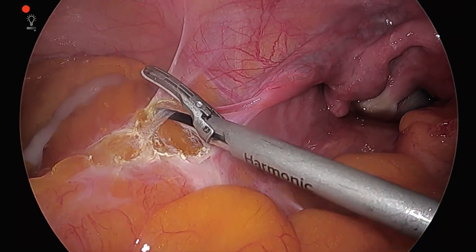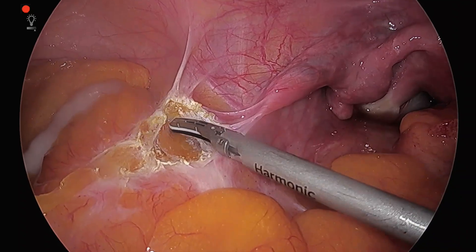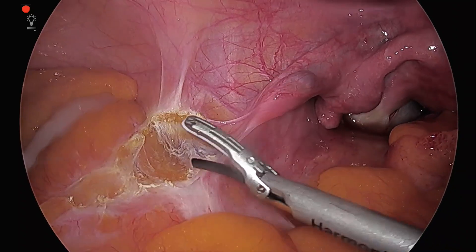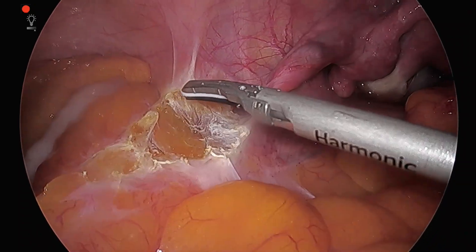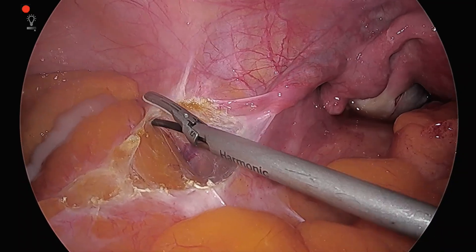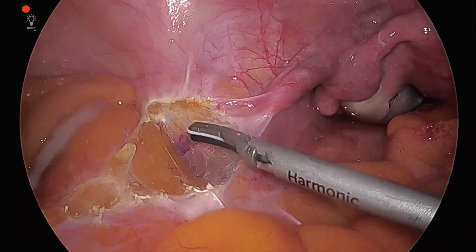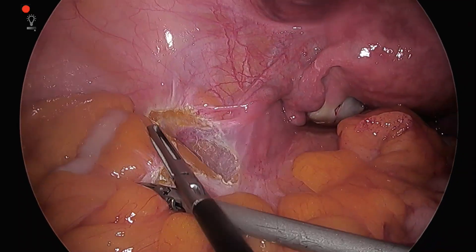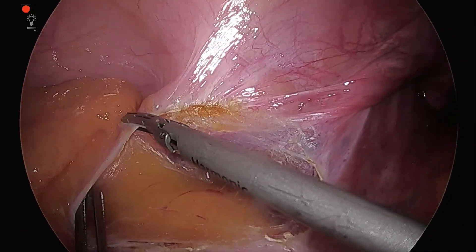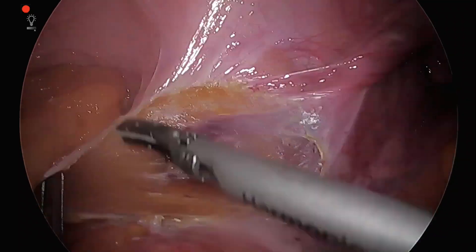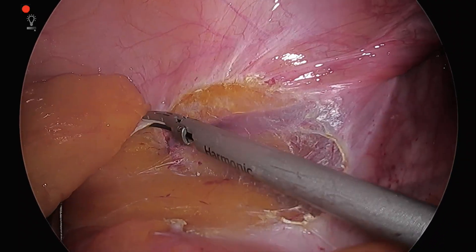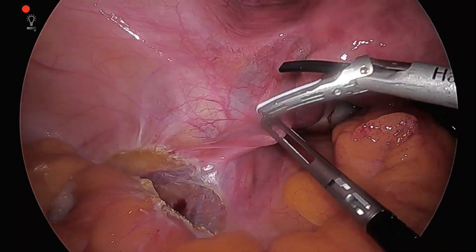Just in case the rectum is too adherent, we would like to mobilize the sigmoid so that we can develop the pararectal spaces. Since the patient is only 37 years old, the plan is right salpingectomy and left salpingo-oophorectomy along with the diseased ovary, the endometriotic cyst, and the dermoid cyst.